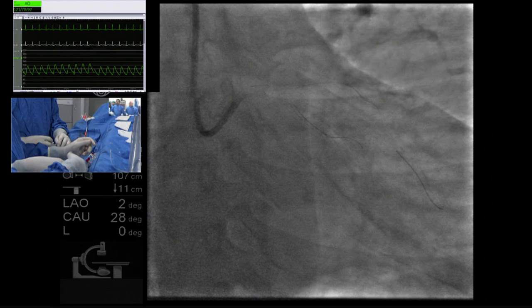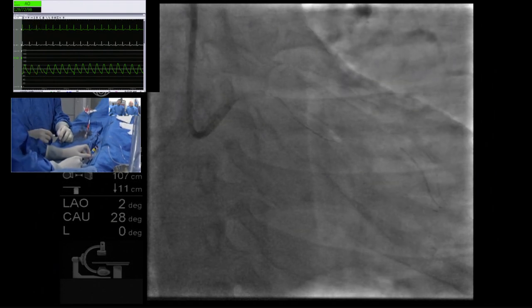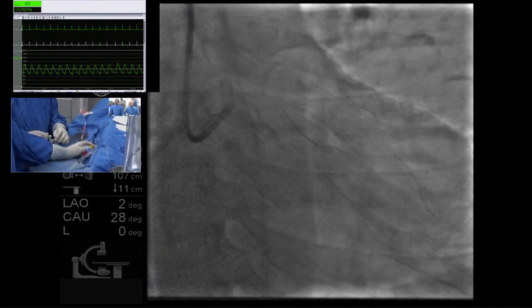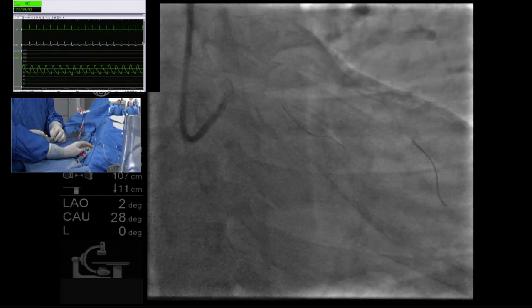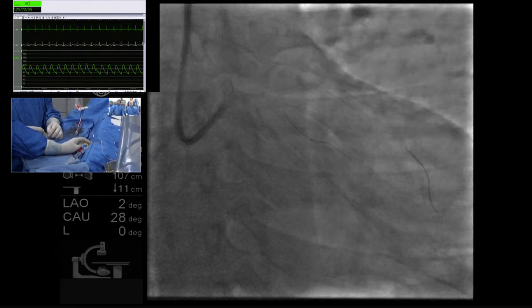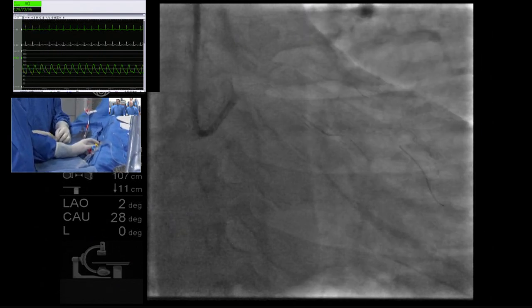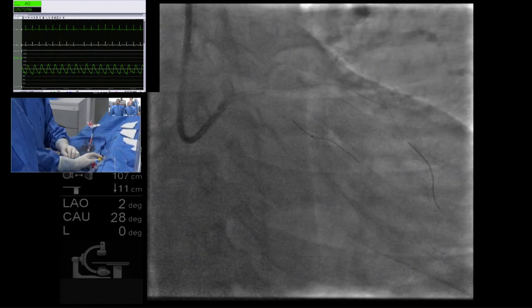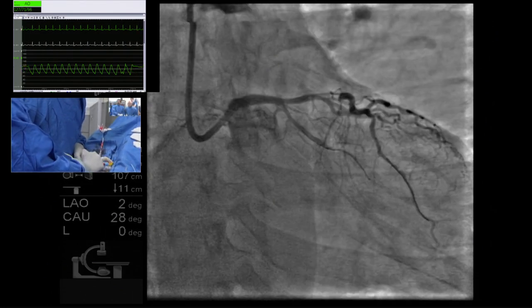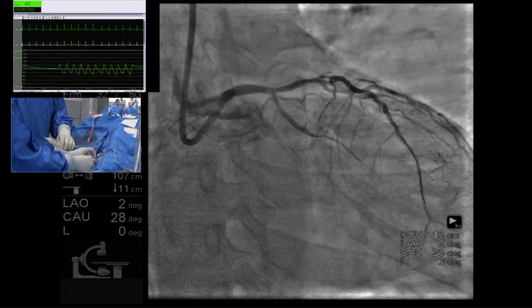If you get a condition where you have an ostial left main narrowing, as in this case, you have seen in the check angiogram that it showed ostial narrowing, but with the help of the diagnostic catheter, you don't see any pressure damping. Now, say for example, if you do an IVUS in an ostial left main without any atherosclerotic plaque at the region of the ostium, and the distal part of the left main is normal, but the ostium of the left main is narrow, still I feel strong external resistance, compression. Do you stent that part of the left main without any atherosclerotic plaque? True lumen, sir. But the ostium of the left main is narrow.